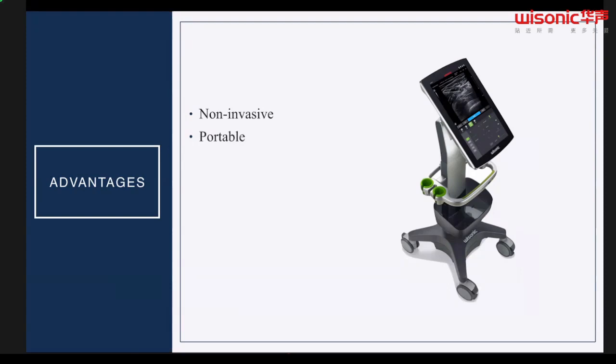But ultrasound, you can bring it right up to a person's bedside, wherever they are. It's very easy. It's portable. It's great for whatever practitioner or provider is using ultrasound. It's very portable, very cost effective in comparison to MRI, CT scan, in terms of what you can see on it and the cost benefit to it.